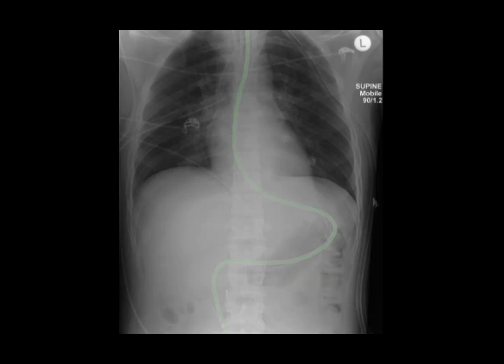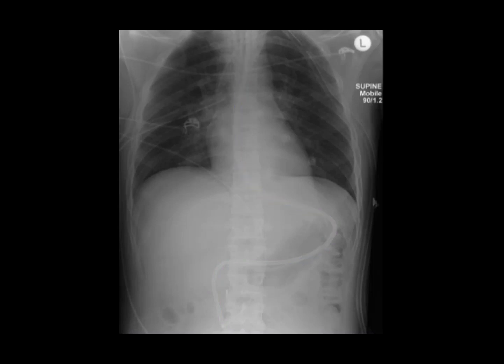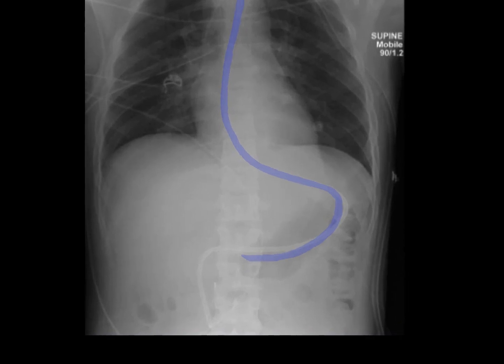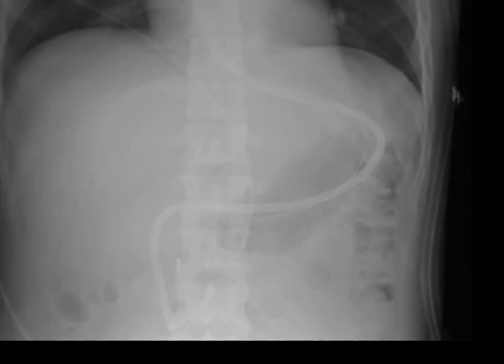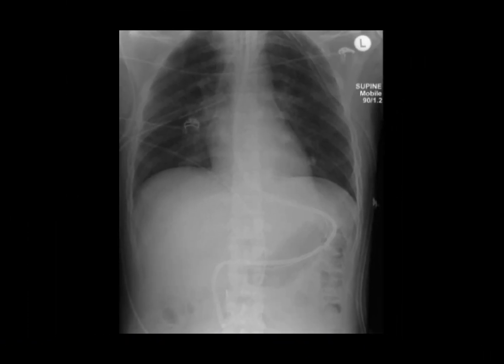A little bit more difficult to see is the nasogastric tube. You'll see that the proximal port of this particular type of nasogastric tube is very close to the tip, and both of these tubes would be considered in good position. Two more devices that are a little bit more difficult to spot on this examination are the left internal jugular vein central venous catheter and an IVC filter.